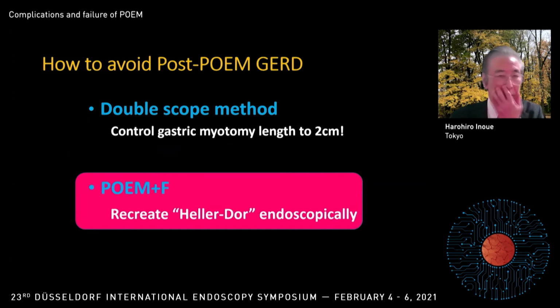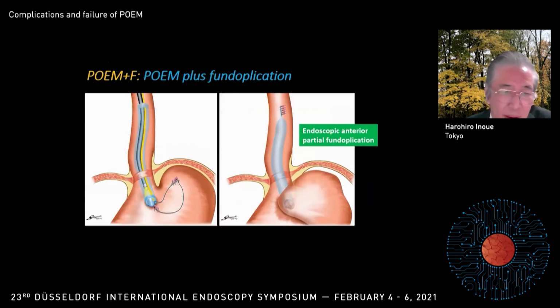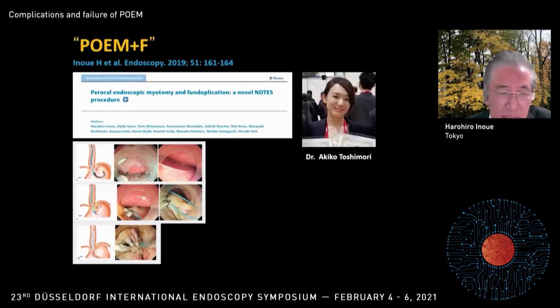Okay, so once a patient develops severe GERD, how do we manage those patients? Now we recommend POEM plus fundoplication. That is a pure NOTES procedure. In this way, we place a fundoplication similar to Dor. We have already published the technique.